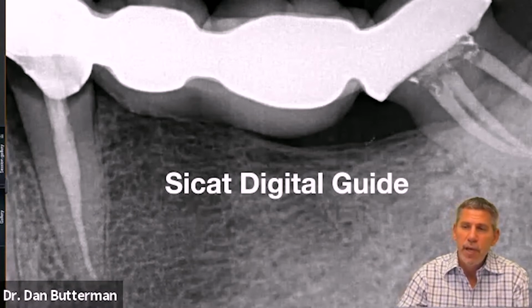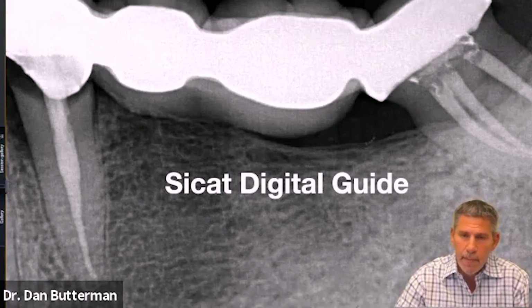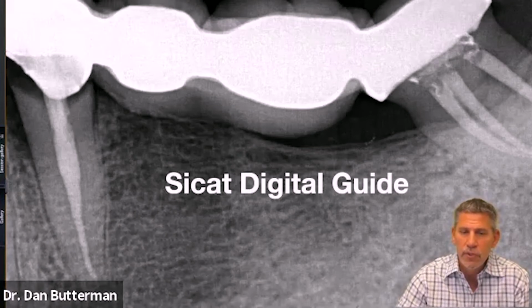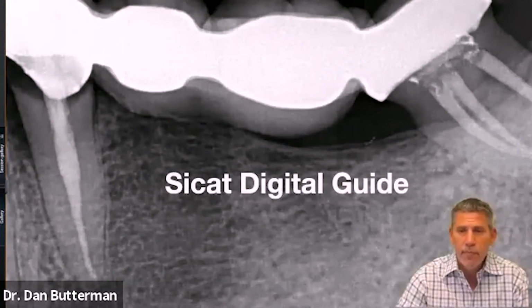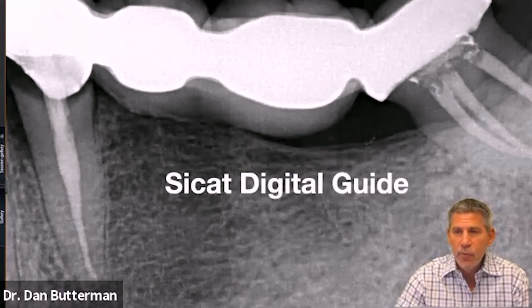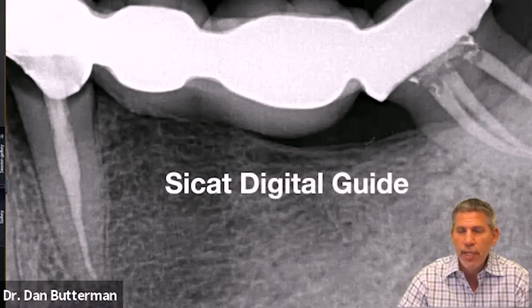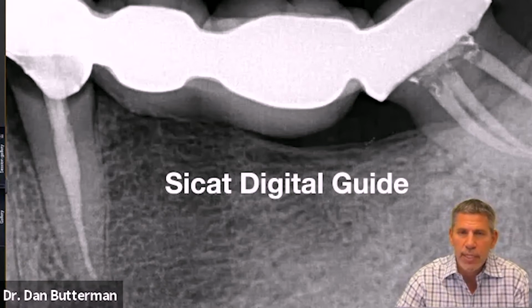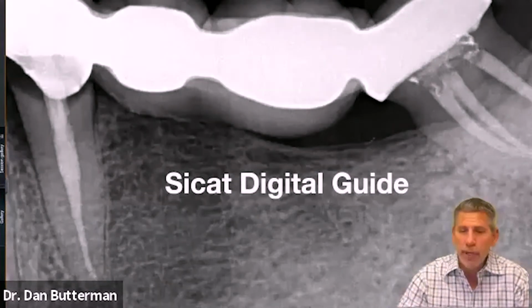So here you can see we've got a bridge, a 4-unit bridge, and we see this all the time. The anterior tooth was fractured and was disconnected from the bridge. The posterior tooth had quite a large vertical fracture as well, and there was an abscess. So we were going to be losing both of those teeth. Now, I didn't feel like we needed to take this all the way back to tooth number 18. I wanted to do just a 3-unit bridge instead of a 4-unit bridge. We didn't need that. He didn't have anything opposing, quite honestly, that terminal molar there.